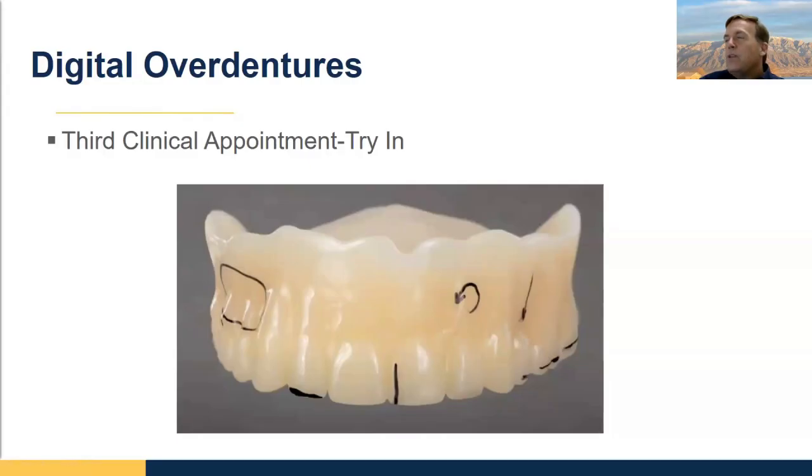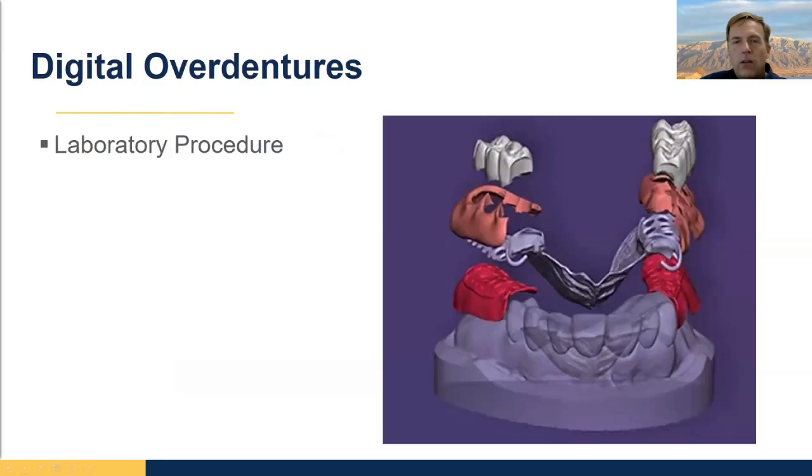And so I would say, with this process, you've got 2 opportunities to get the border right where you want it. And that's also an advantage to the try-in. If this border is shortened, then your patient can try it for a few days and say, oh, I really like that stability, or, oh, I feel like it's a little bulky, or, it's moving around a lot. Can we do anything about that? So you can make those decisions before you go to the final restoration.